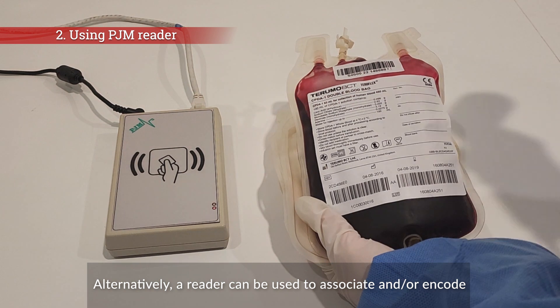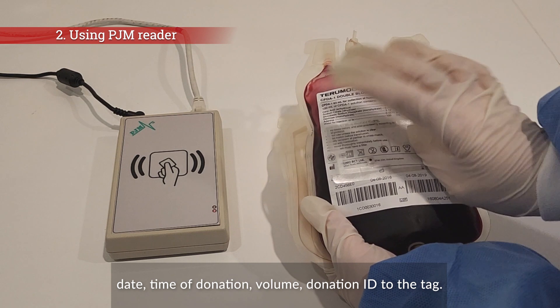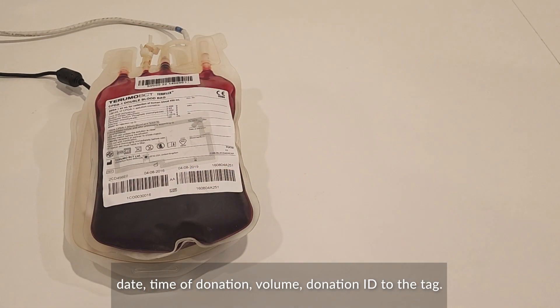Alternatively, a reader can be used to associate and/or encode the donation ID and any additional information, such as date, time of donation, and volume to the tag.